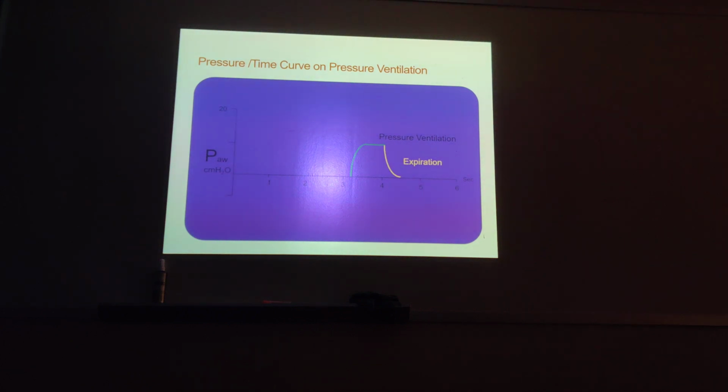The more you turn up your rise time, the slower it will go like that. But if you have your rise time at 0, what you're going to see is like that. It shoots out like that. So if we didn't have the rise time, then this would be like a square.